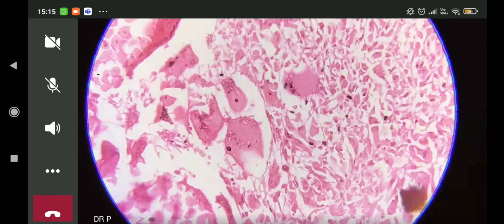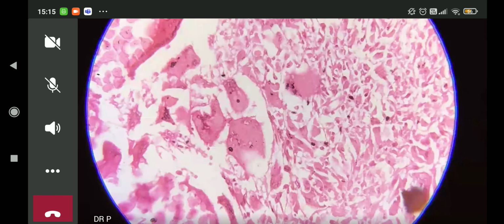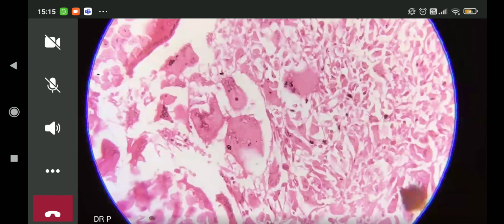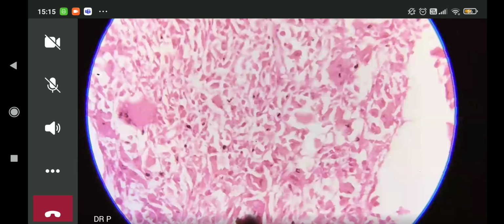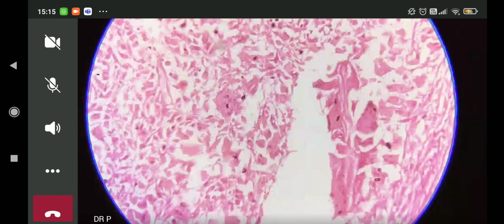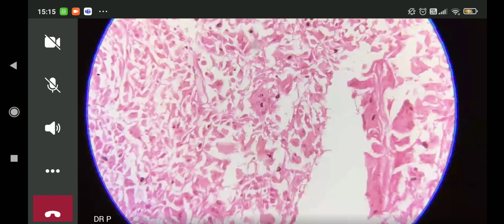So this is what you have: foreign body giant cells and this suture material. Histiocytes are very infrequent. Here there's a giant cell, and to the left of the giant cell, the 4-5 nuclei you can see are all histiocytes. But by and large, you have inert looking suture material.